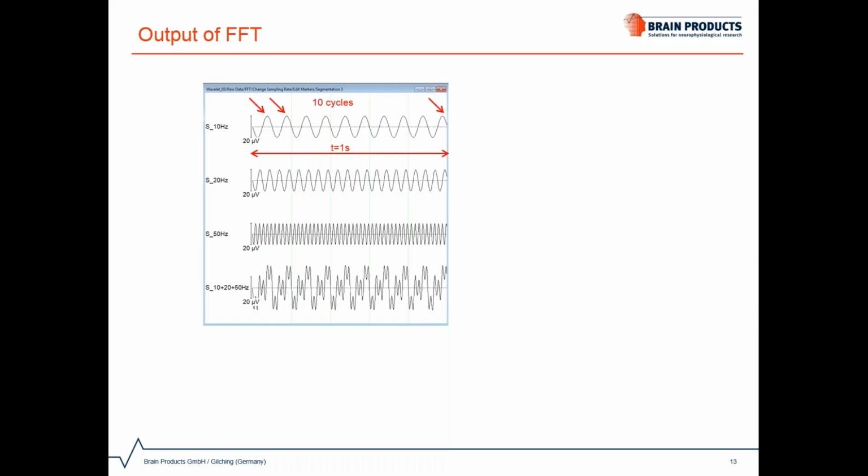Similarly, if we count for the second and third signals, they oscillate with a frequency of 20 and 50 Hz respectively. The last signal corresponds to a linear combination of the first 3 sinusoidal signals. This is more similar to what we would expect to see in real EEG signals, where we know that we have a contribution of multiple frequency components.